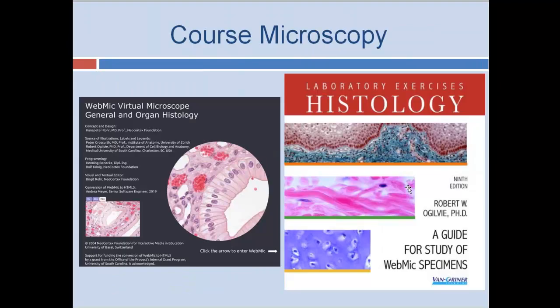So the primary resource for microscopy in the course is WebMic. You can see on the right, and when you get in there, you can see that the concept and design, originally, back before 1999, was conceived by Dr. Hans-Peter Rohr, a medical doctor and pathologist in the Neocortex Foundation of the University of Basel.